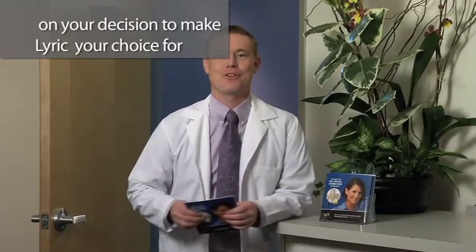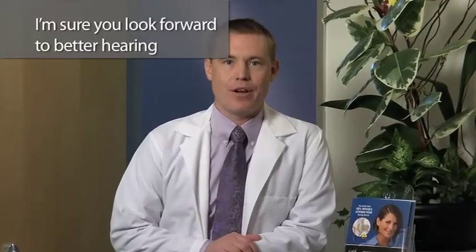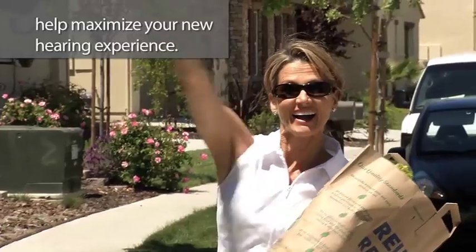Hello, and congratulations on your decision to make Lyric your choice for invisible, extended wear hearing. Like most people who choose Lyric, I'm sure you look forward to better hearing 24 hours a day, 7 days a week with a device that's totally invisible and hassle-free. In the next few minutes, I'd like to share some important information with you about your new Lyric hearing device, including some tips to help maximize your new hearing experience.